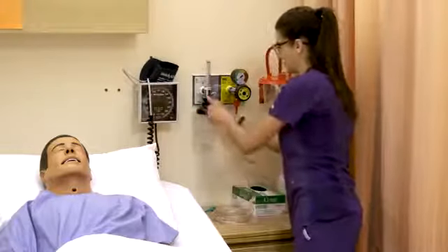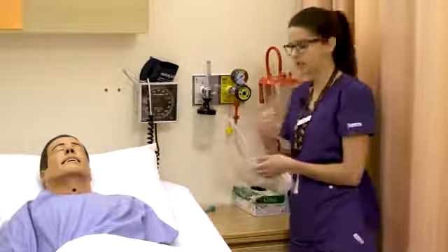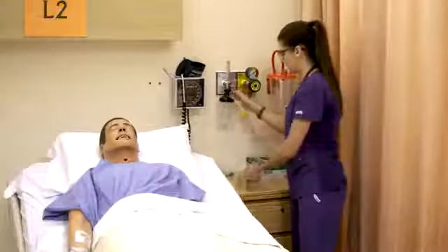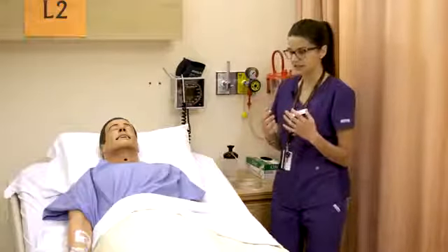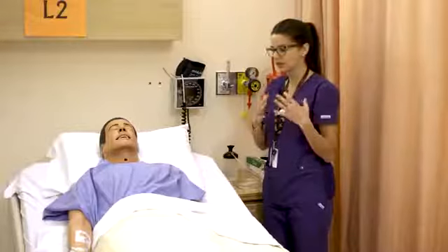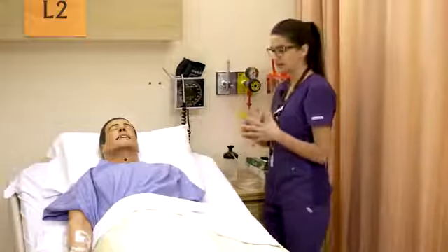And then we'll hook up our oxygen and say we're going to go to 5 liters, and you'll see it bubble. So that's going to provide some humidity to the air, so it's less drying for the person. And that brings us to, because of the drying effect of oxygen, sometimes it's instinctive to want to put Vaseline in their nose or on their lips, but we don't allow petroleum-based products around oxygen because it can ignite.